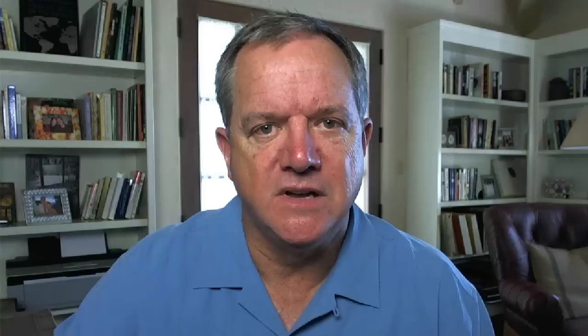In this instance, it's a patient I treated years ago, probably late 1980s, early 1990s. She has some implants on the lower left. They are splinted restorations, placed with temporary cement — straight temp bond. And sure enough, years later, the abutment screws have loosened. So what I'm going to do is show you how to create a fulcrum and use a toothbrush — actually two toothbrushes — and a little dental aid from the hygienist to create that same fulcrum. So let's go ahead and watch the video.